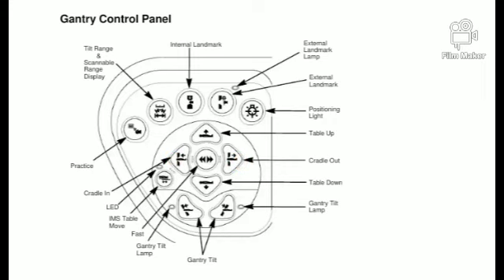So from our midpoint we'll just move upward. Now you can see that is one practice button. Don't press it unless it is necessary. Even if it is not necessary, also don't.